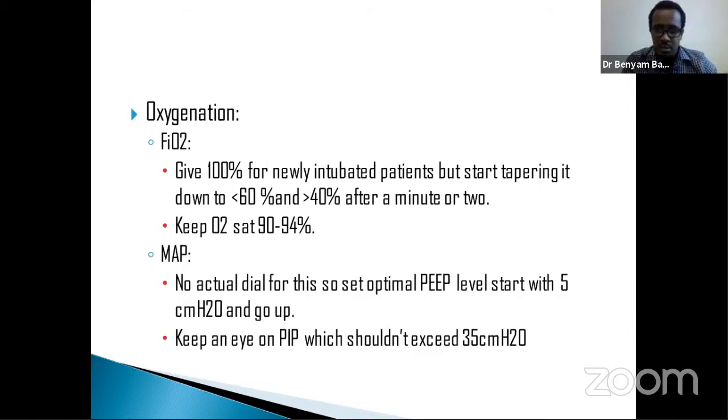And whenever you increase any pressure, be it PEEP or pressure, always keep an eye on the peak inspiratory pressure. It shouldn't exceed 35 centimeters of water. Even if it exceeds in case of ARDS, it should be temporary. It should be reverted as soon as possible whenever the hypoxemia is resolved.